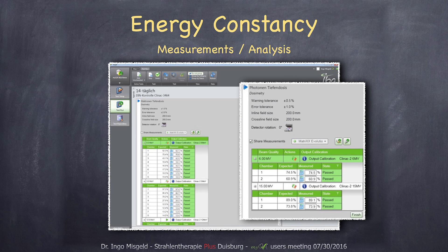As I said, measurements are performed every 14 days in our department. The only thing you have to do is connect the detector to the network, do a zero measurement, and then your actual measurement. You can add notes and descriptions of what has to be done, how the setup is, and how many monitor units you have to apply. Right after the measurements, they are evaluated and you can see whether they passed or failed — the same for photons.